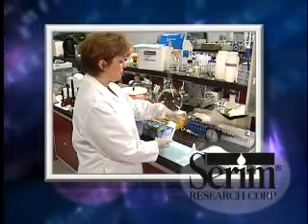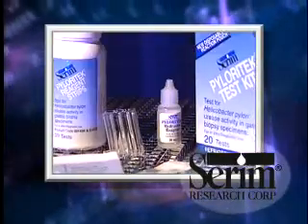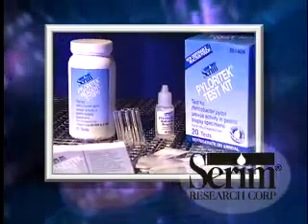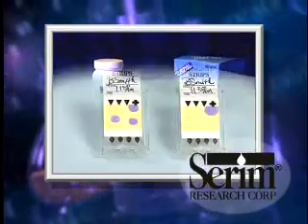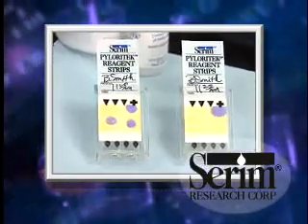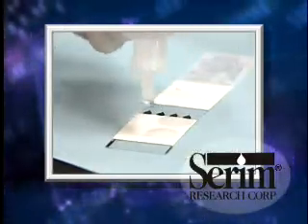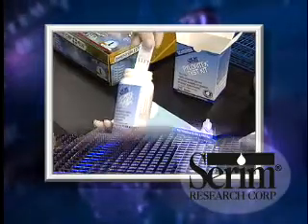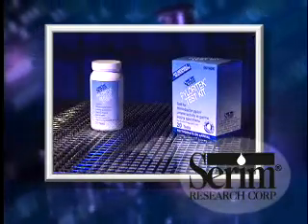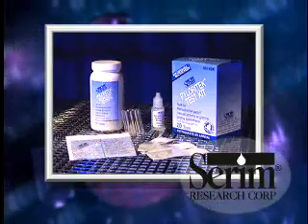The following video will lead you step-by-step through the proper use, storage, and handling of the Pyloritek 1-Hour Rapid Urease Test Kit. Developed by the Serim Research Corporation of Elkhart, Indiana, the Pyloritek test strips have been highly acclaimed for their ease of use and quick, accurate results. As you follow the simple procedures outlined in this video, you'll understand why the Pyloritek test kit is the smart choice for the presumptive indication of H. pylori.